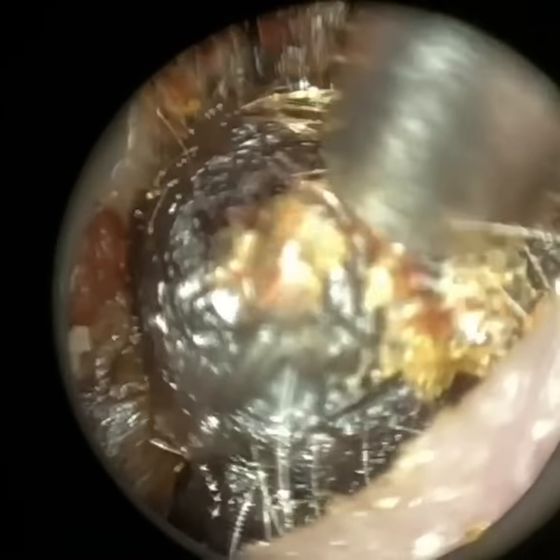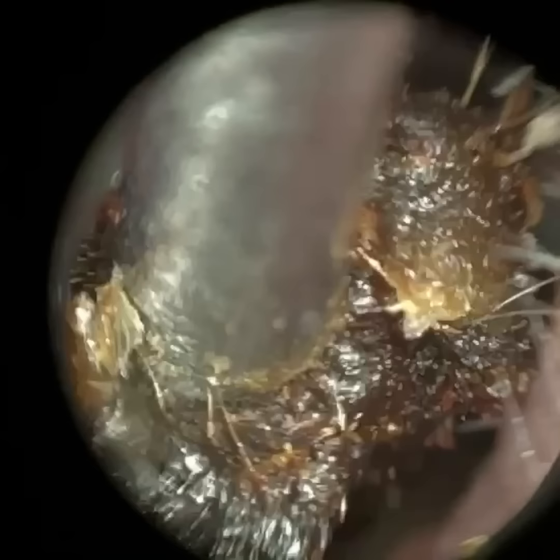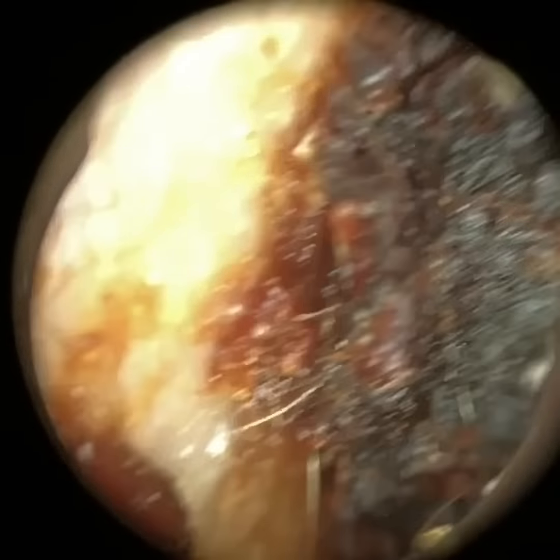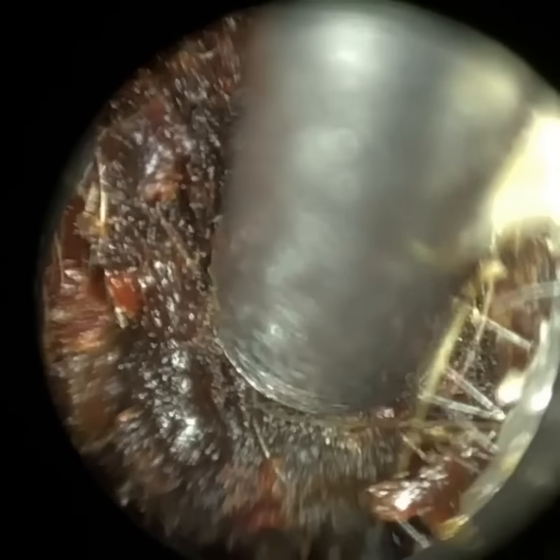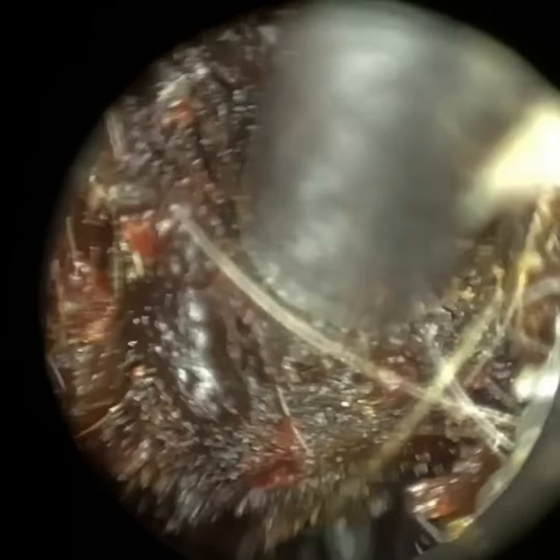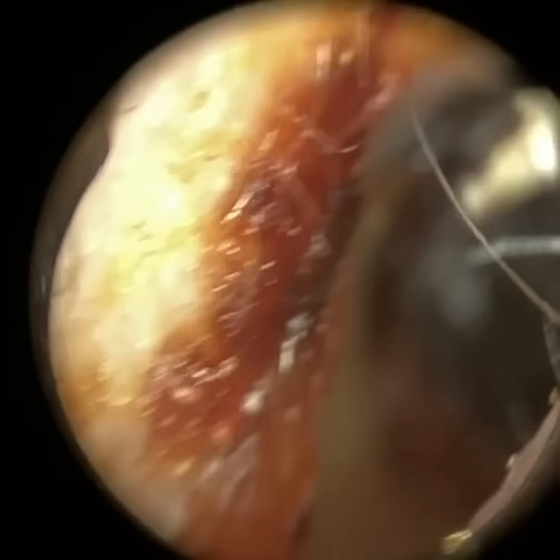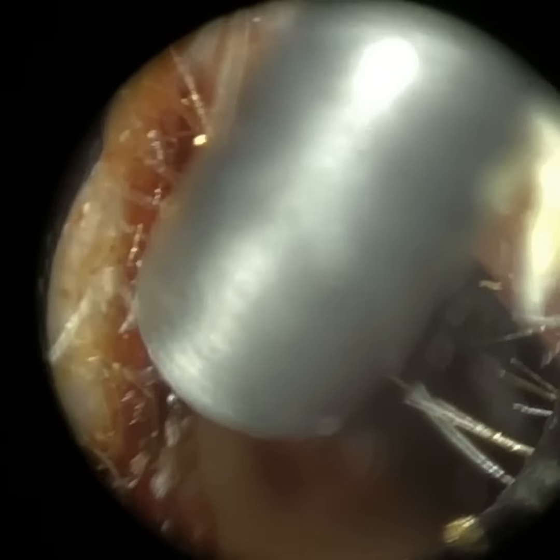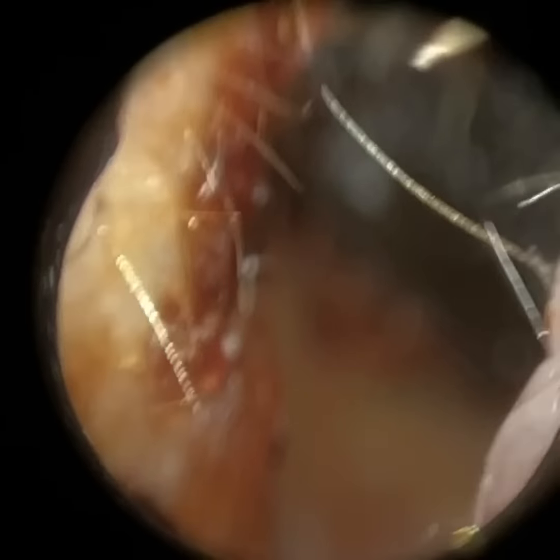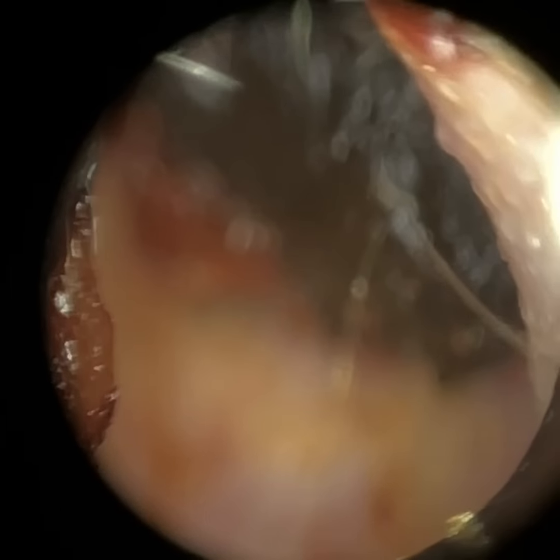You can see the wax is getting somewhat trapped here. I'm going up and then over this part of the ear canal, and I've removed a sizable chunk. Judging by the colour of this wax, it's been there for a while — it's been 18 months since this patient last attended and the wax is oxidised. No doubt one of the reasons for the wax buildup is their narrow and bendy ear canal. Earwax tries to migrate out of the ear but has to navigate the bends and anatomy, so in a narrow or bendy canal, the wax can get trapped.